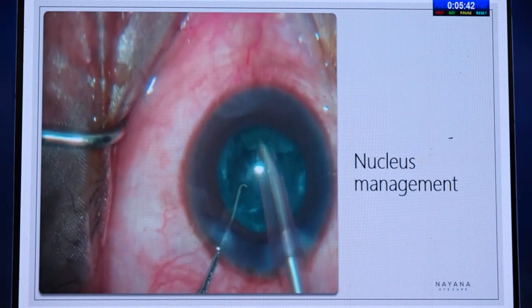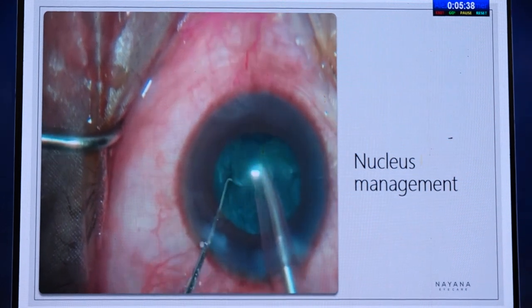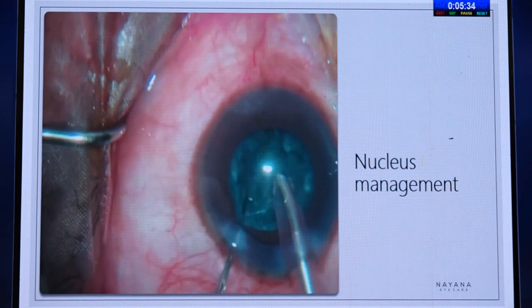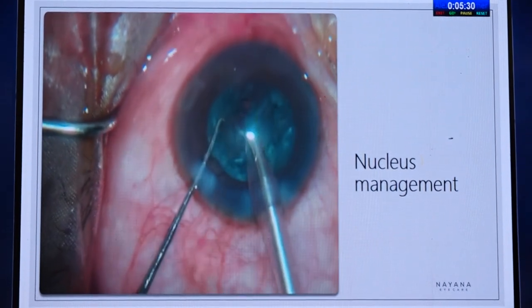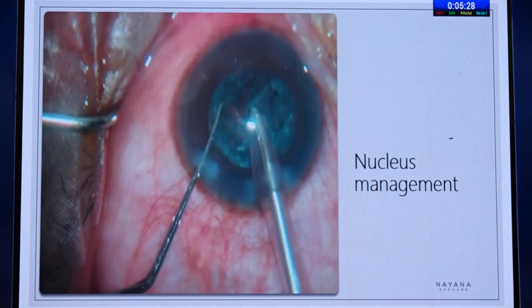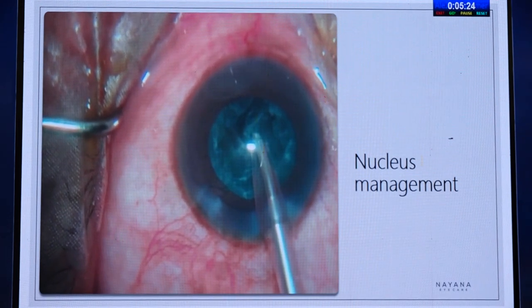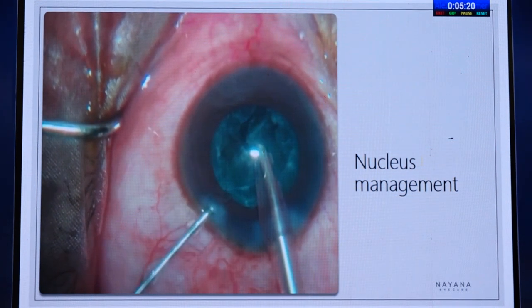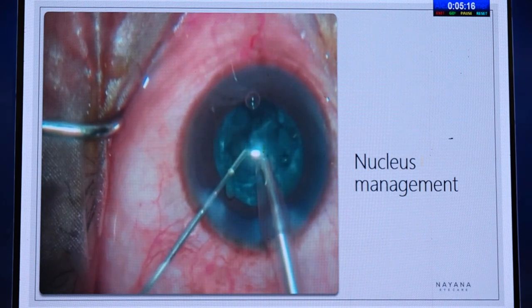By this time, if nothing is going as per plan, you have to suspect that something bad has happened. And by something bad, I mean there must have been a PCR. Watch closely there. Sudden momentary expansion of pupil, sudden appearance of red reflex. The most important thing here is, do not remove your phaco probe immediately. Inject dispersive OVD into the eye.